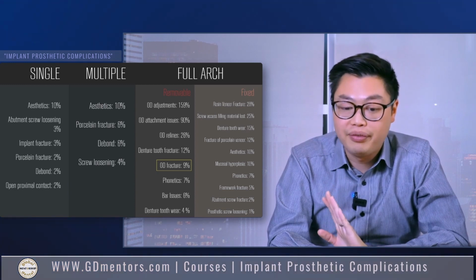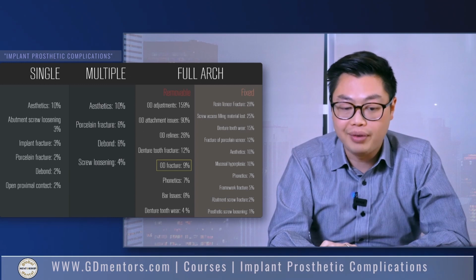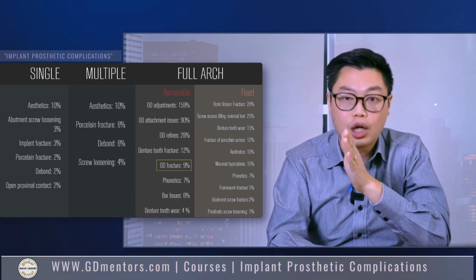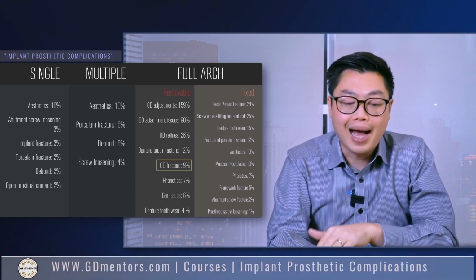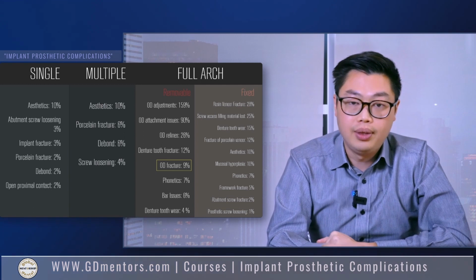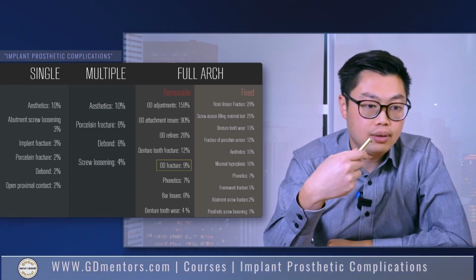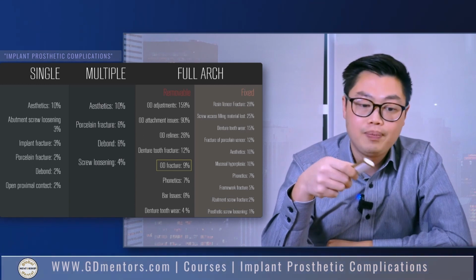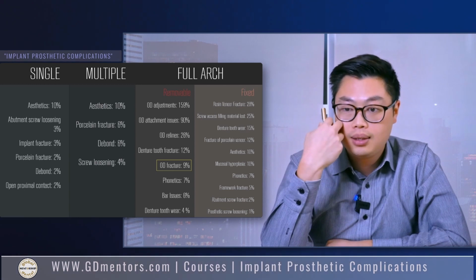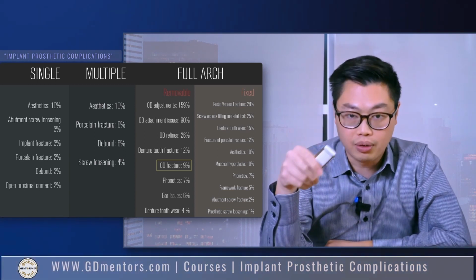However, it does not prevent denture teeth breaking, and it doesn't prevent denture fractures, okay? Acrylic fractures. If you actually add a metal substructure, the acrylic is actually weaker, okay? Because you're actually utilizing some of that space to do metal. By the time the metal actually takes on some forces, the acrylic has probably cracked already.